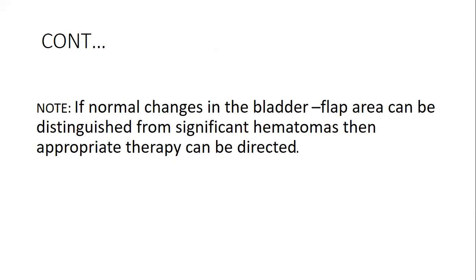But the key point that is very important in this presentation is to realize that if normal changes in the bladder flap area can be distinguished from the significant hematomas, then appropriate therapy or treatment can be directed, because it's going to give them to say, oh, the incision site is okay, or there is a hematoma of this much. They can go back and remove whatever is there, or they can give some medication or appropriate treatment.